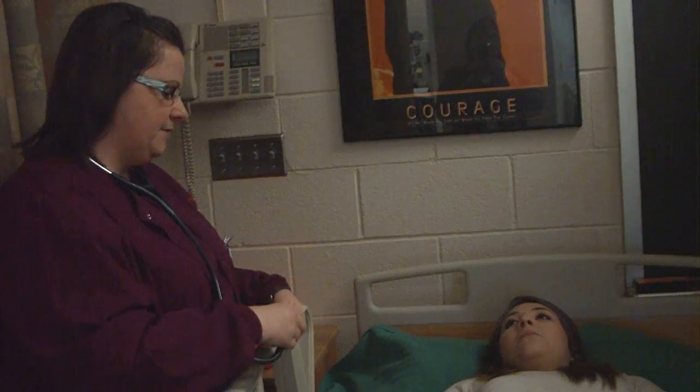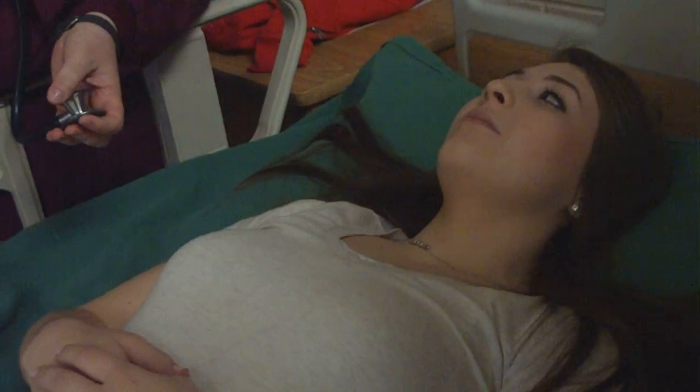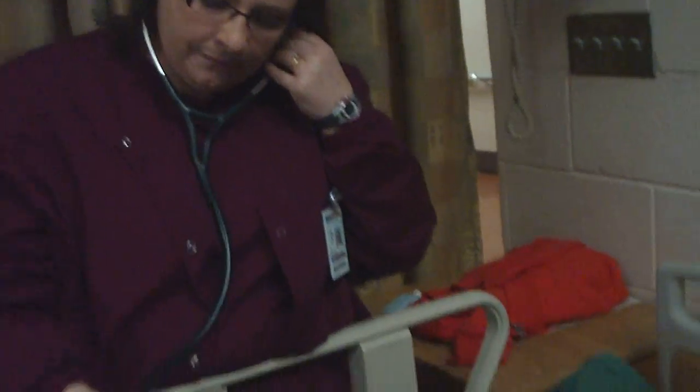Okay, so now I'm going to start with my physical assessment, and I would clean off my stethoscope in front of the patient as well as wash my hands in front of the patient as well. We're going to do lung sounds, and I obviously know that by looking at her, I don't see that she is having trouble breathing. She's not got any labored breathing, she's not got any chest retractions, nasal flaring, so her assessment right now is regular or unlabored breathing.